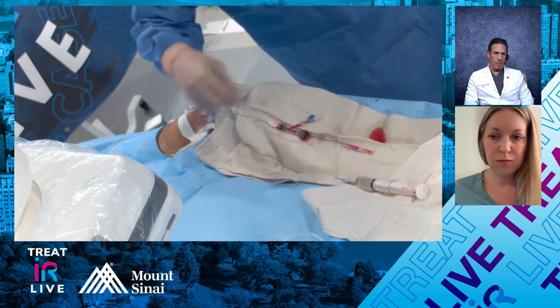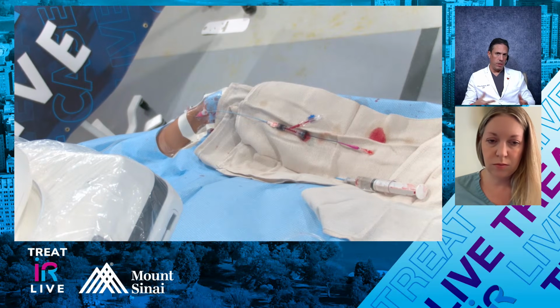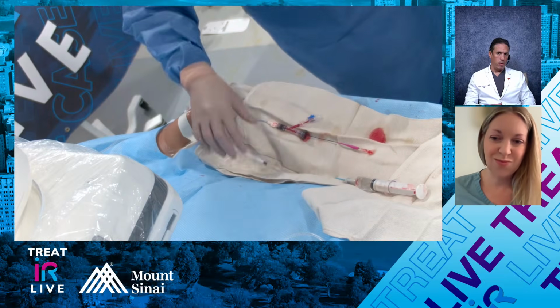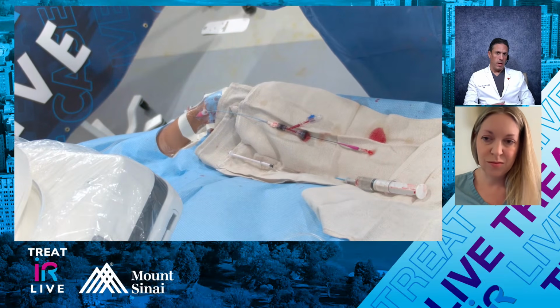That's interesting here. When you have a young patient and their aorta is very narrow, I think the vertebral shape is fine. When you have an older patient with a wider aorta, it's harder with a vertebral shape to get into the IMA, and so that's where, as Jesse mentioned, the TIG or the Sarah would be more beneficial for that scenario.